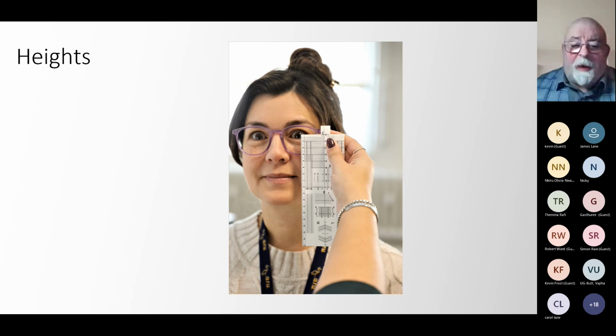In the event that we've got a patient with Parkinson's or a head shake or a head tremor, then this will help steady everything with the patient. Now, we're showing this being taken on the patient's left eye. We would repeat this on the right eye. And again, just to reiterate, once I've taken these measurements, I would make a dot on the dummy lens and just have a look and make sure it is where I thought it was going to be. I've taken the dummy lenses out of this frame so that we didn't get a reflection from the dummy lens when we took the photograph.